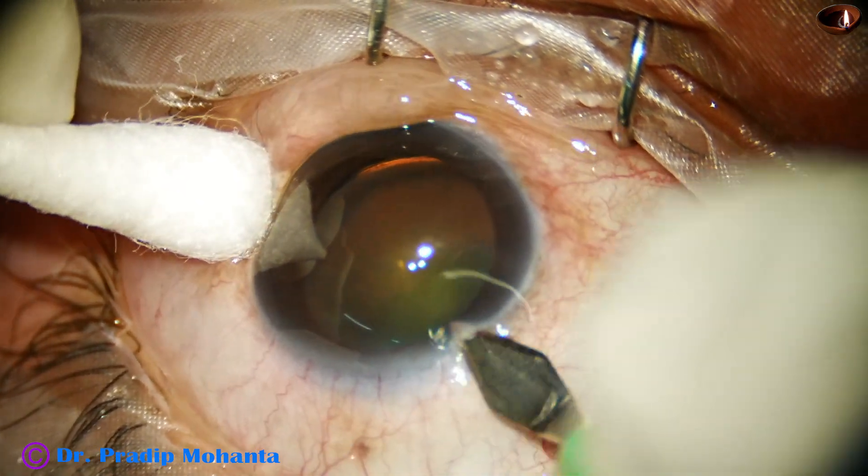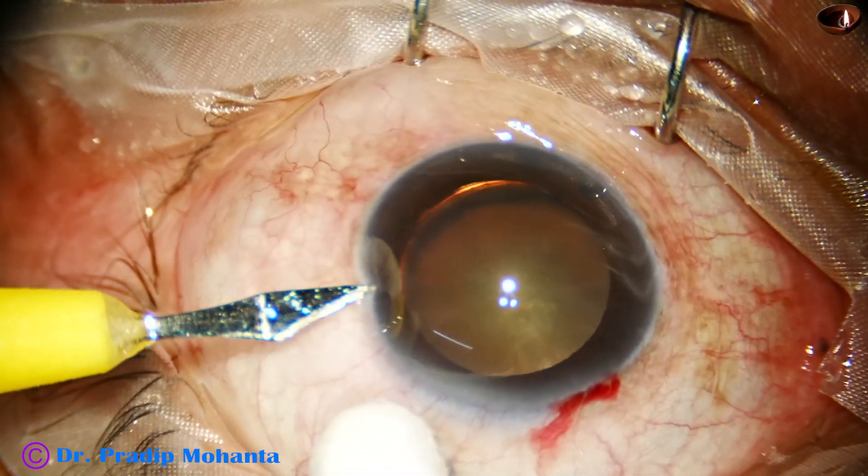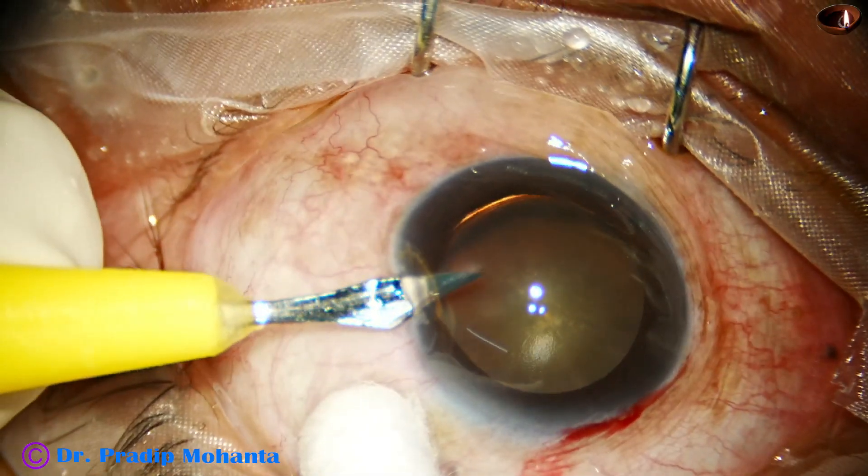We have started this surgery. This is the main wound with a 2.8 mm steel keratome. A side port is made on the left side of the main wound.